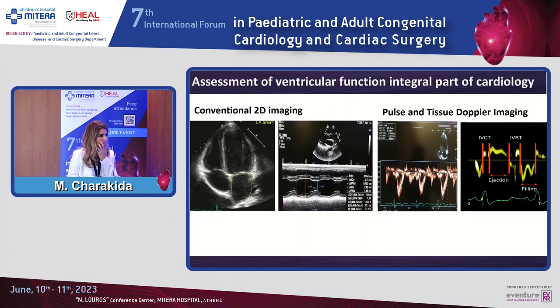We all know that assessment of systolic and diastolic function of the heart is an integral part of our cardiology assessment, not only for congenital heart disease patients, but also for patients who are referred without congenital heart disease just in the outpatient cardiology clinic.